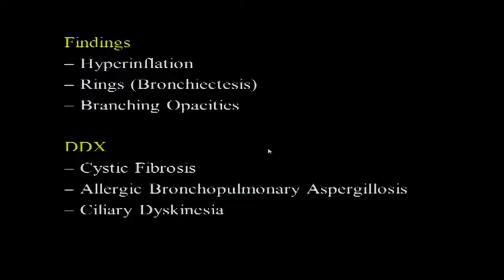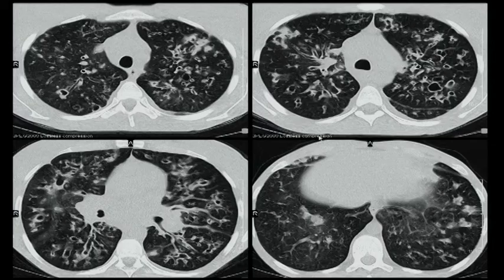Cystic fibrosis. It's a young patient. If you see the x-ray, the shoulder, it's a young patient. So correct, this is cystic fibrosis. Well done, Sylvia. Differential diagnosis will include ABPA because of the mucoid impaction, and ciliary dyskinesia, which is a big umbrella term that includes the immotile cilia syndrome, and those patients will give a history of infertility, right? I'm just saying that mucoid impaction may be seen in ciliary dyskinesia. That's a differential diagnosis for mucoid impaction.